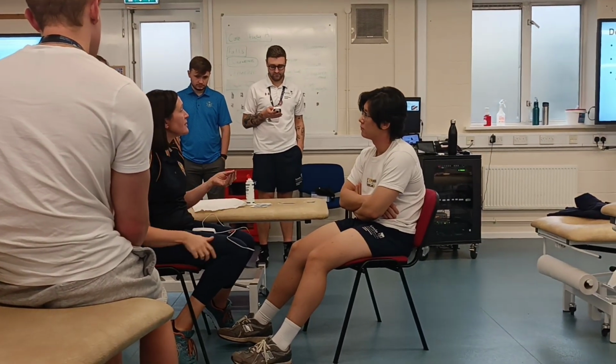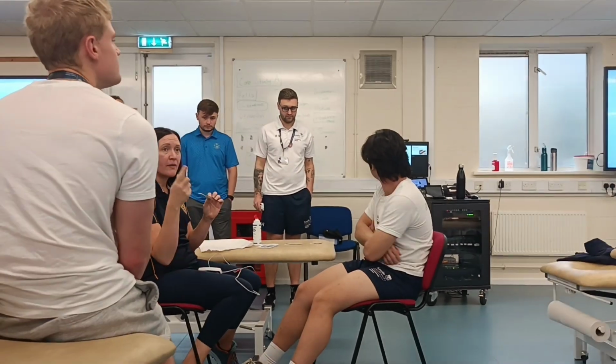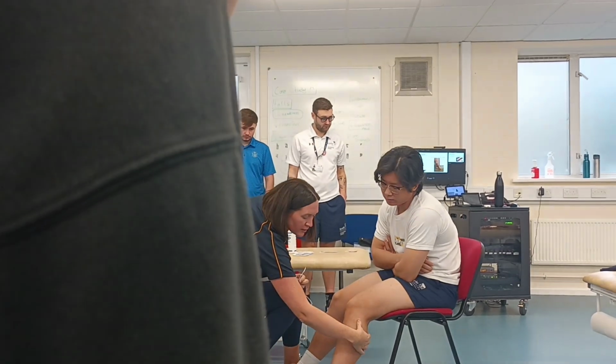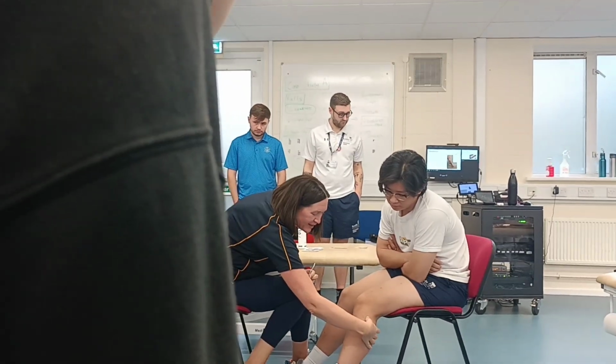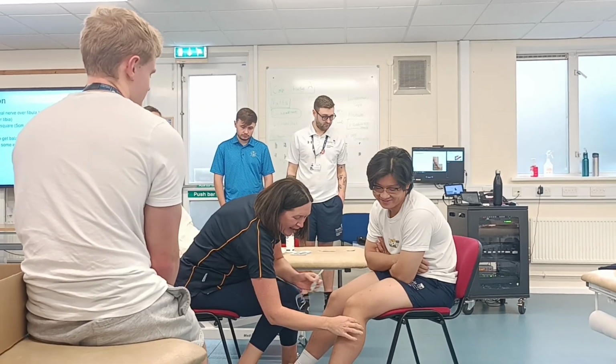So I'm doing dorsiflexion first. So I'm trying to get the common peroneal nerve where it wraps around the head of the fibula. That's the easiest place to find the common peroneal nerve. So I'm going to palpate, nice peroneal fibula head to find. So I've got the fibula head.